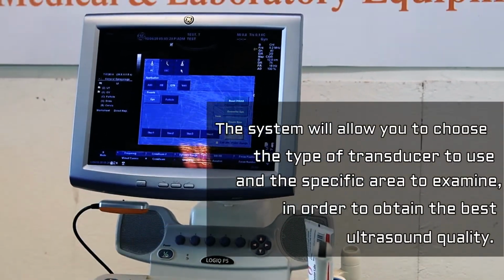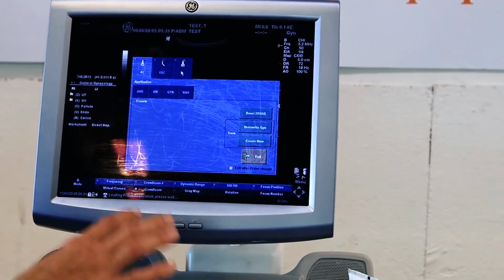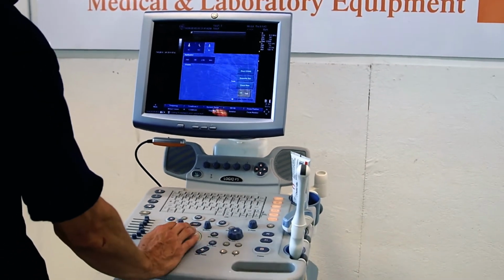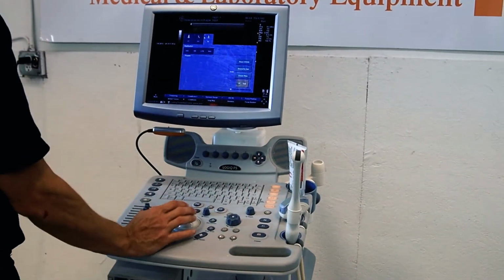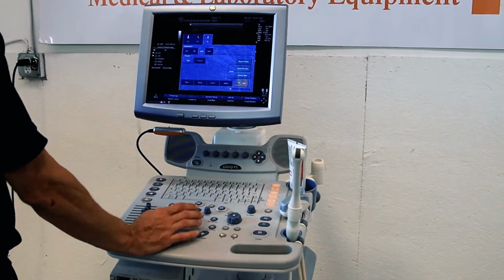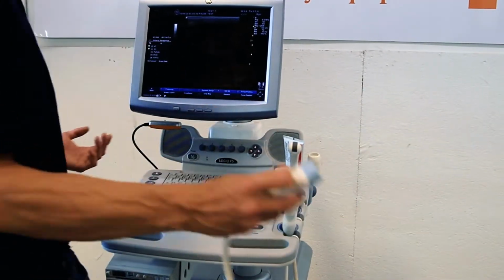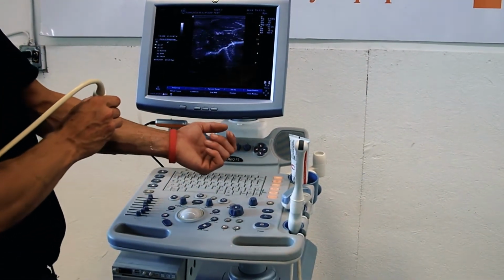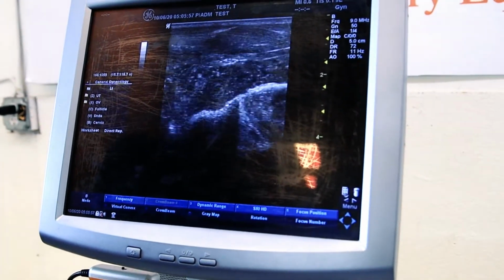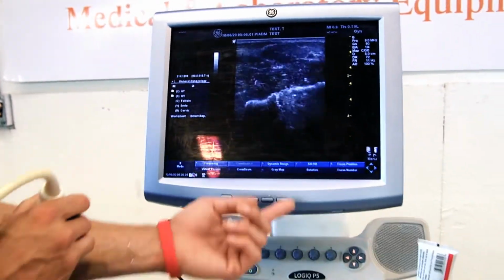We'll do the linear transducer next. So we'll go ahead and select that. It's going to take a moment to switch over here. There, you see how it switched? Sometimes you have to give it a second. You'll come down here, simply hit exit, and then your linear transducer will be operating. Now this is going to be primarily for your vasculars, your linear. The convex is more for abdomen, but as you can see here.